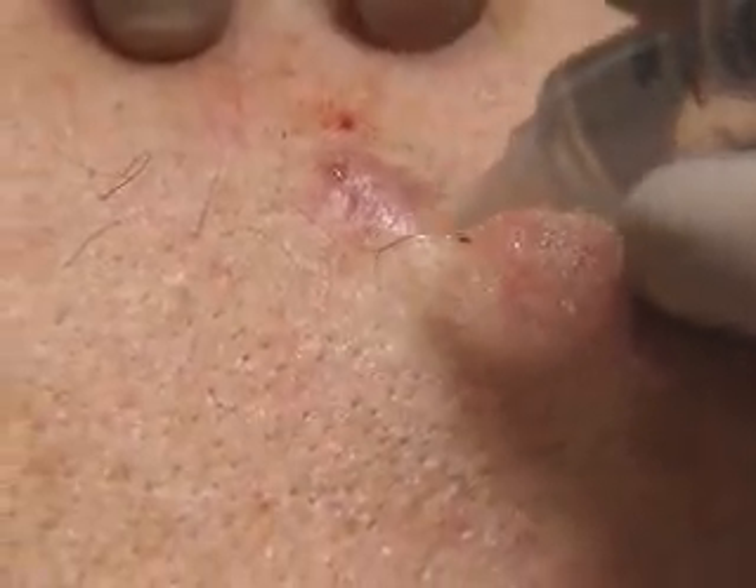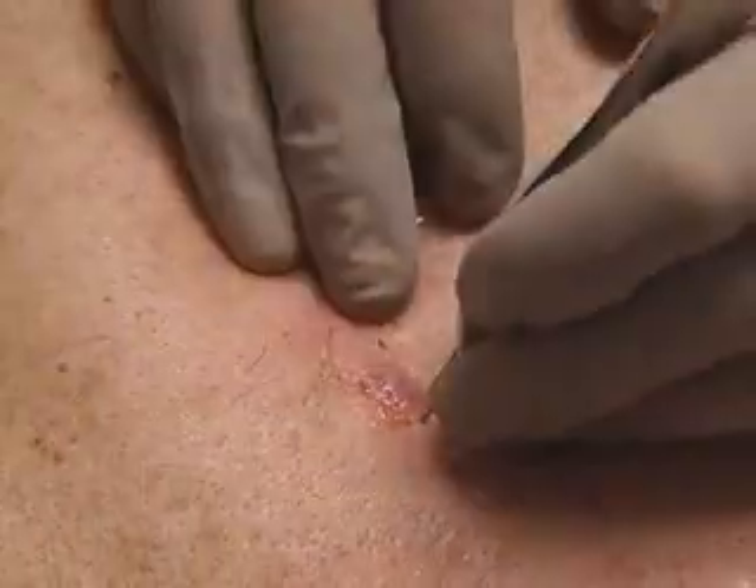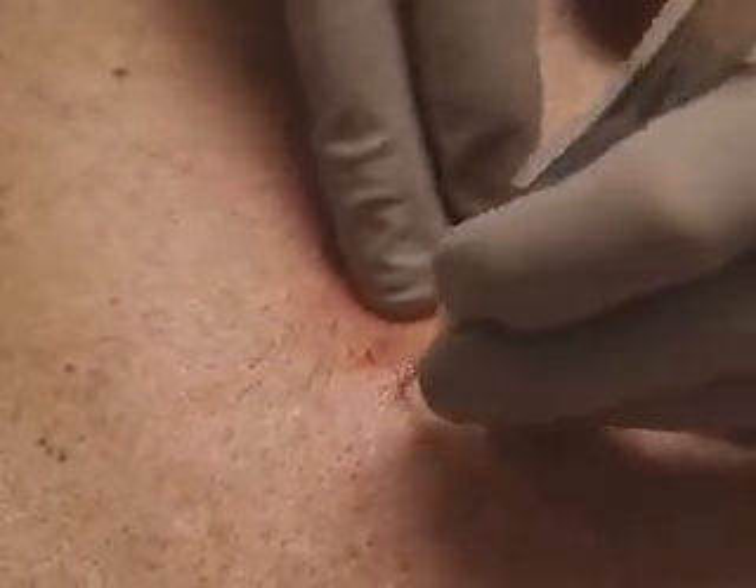Our patient should now have no sensation of prodding or poking if the infiltrate has had effect. A tweezer pinch gives the patient only a slight sensation of pressure. We'll sterilize the site again before making the incision.